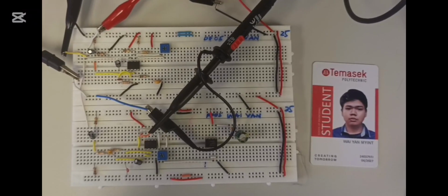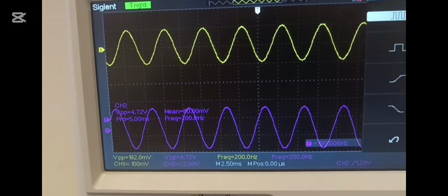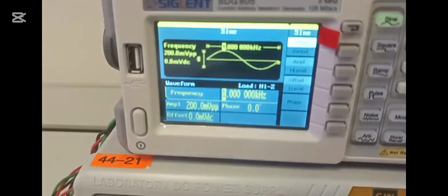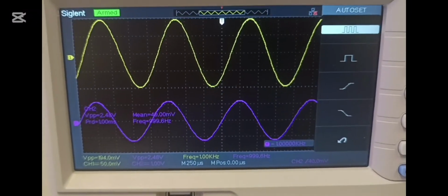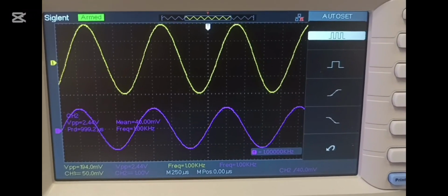So here when I put my test probe to test point 4 and then apply a frequency of 200 Hz, I got a voltage output of 4.8 volt, which is the unity gain. But here when I apply a frequency of 1000 Hz, which is outside of our passband, it is no longer the unity gain and my voltage drops.